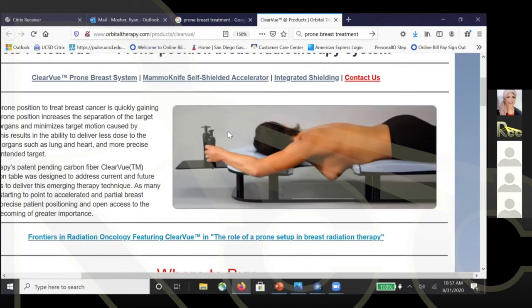I understand. She asked about the tattoo, meaning the location of the lasers. That is out of our scope now, Zahra, but I will deliver it to Ryan. She asked about the laser alignment and the tattoo marks, if any, in the prone case. How can we identify it?